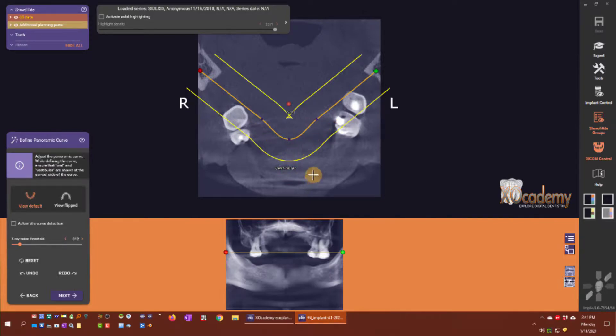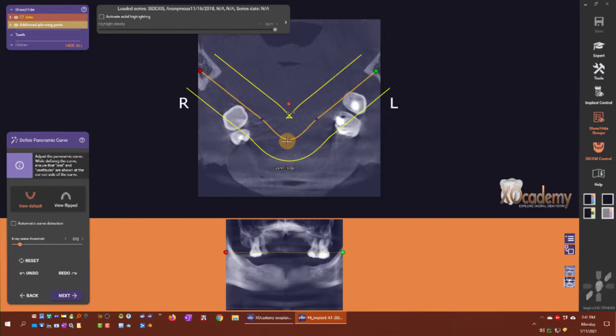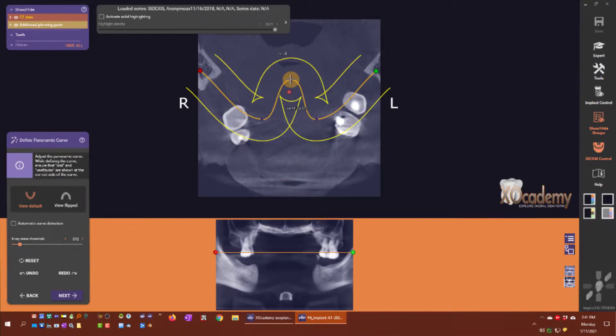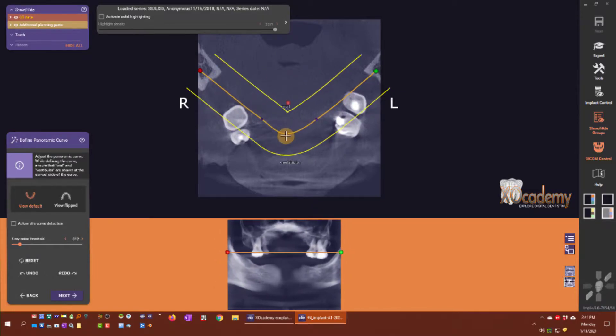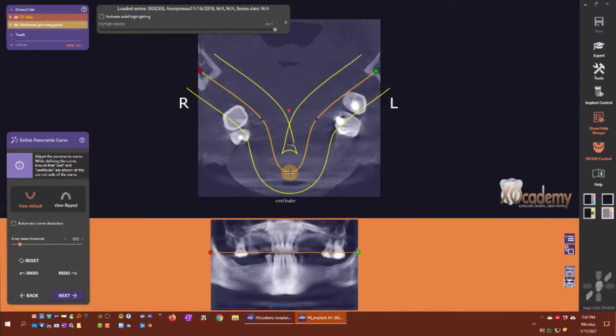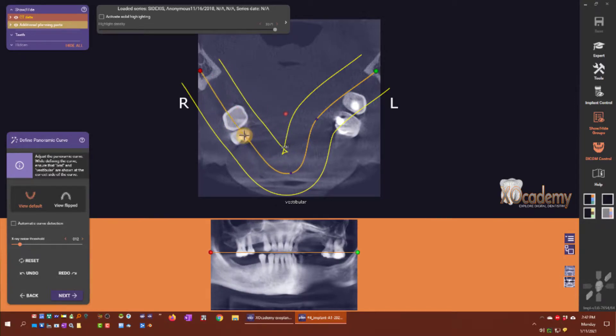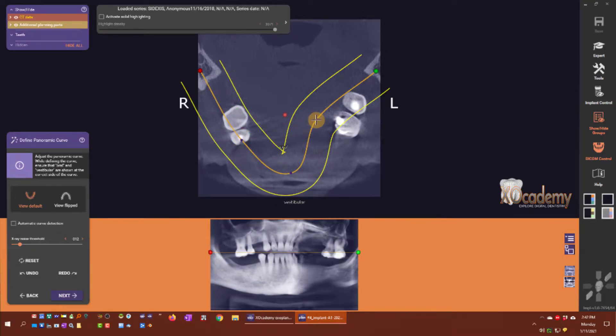You want to make sure that the areas labeled vestibular and oral are in the oral cavity and the vestibule, otherwise you're going to get the inverse relationship. I'm going to move these purple control points kind of where I think on the curve.